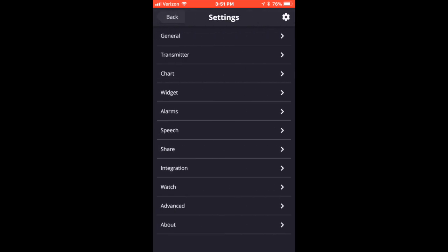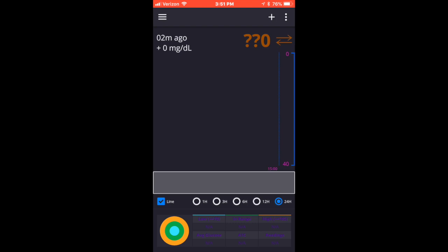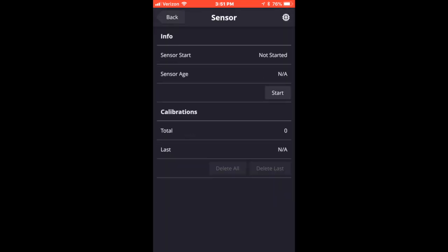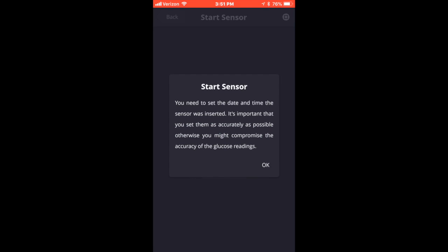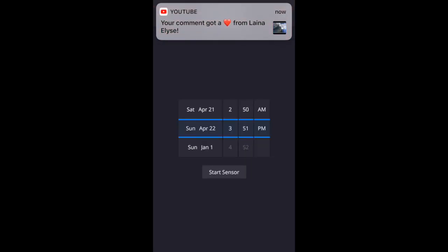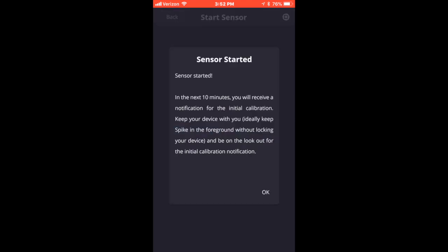Then I'm clicking back and clicking back again so I can start the physical sensor. You click on the three bars in the upper left-hand corner, click Sensor, and you have to enter close to the time you started the actual transmitter for your Freestyle — that way it will go through correctly and you'll get the right readings. I started mine today at 3:25 PM Eastern Time, so I'm scrolling back to 3:25. Once you have that, click Get Started.